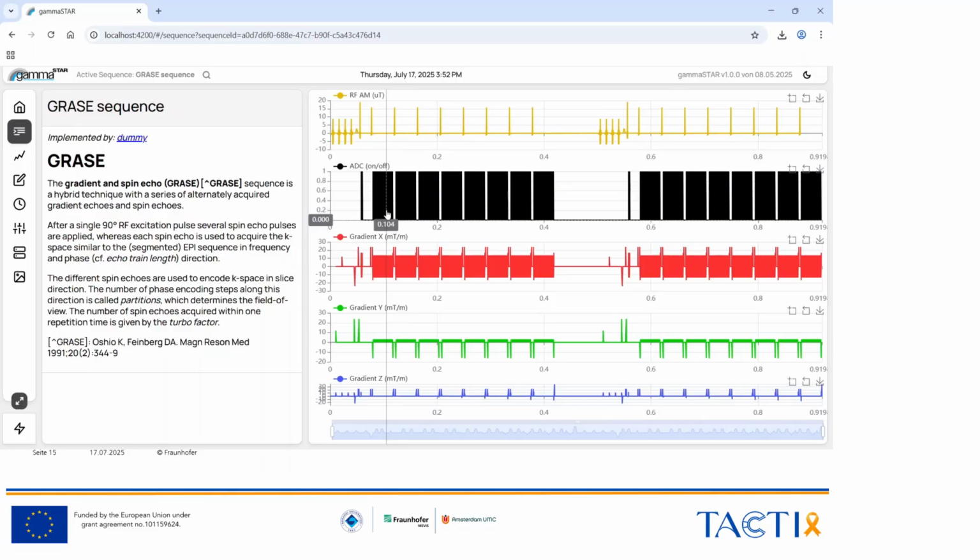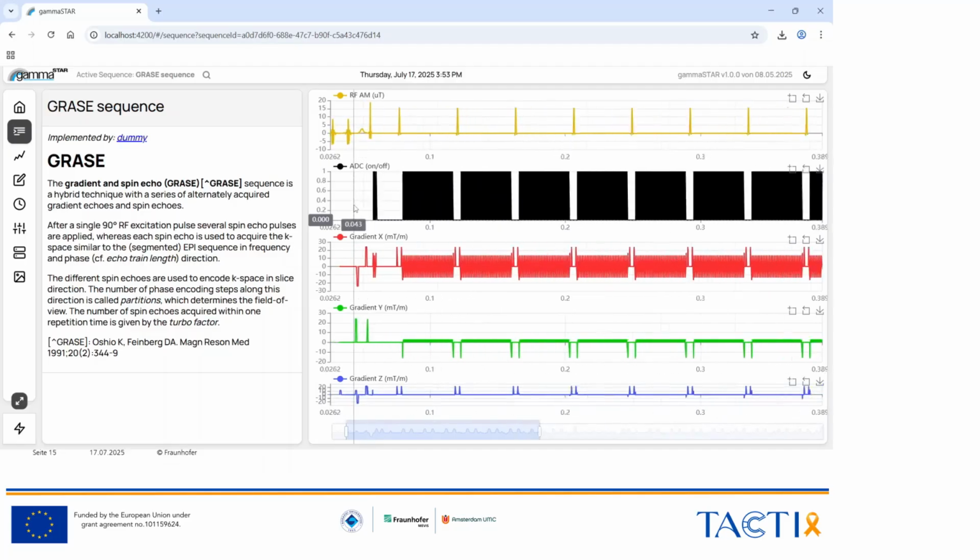So this is a so-called 3D GRASE sequence, which is our favorite readout for arterial spin labeling. There are other readouts being used, but we very much like the 3D GRASE. So white paper recommendation. See? Who wrote that white paper?